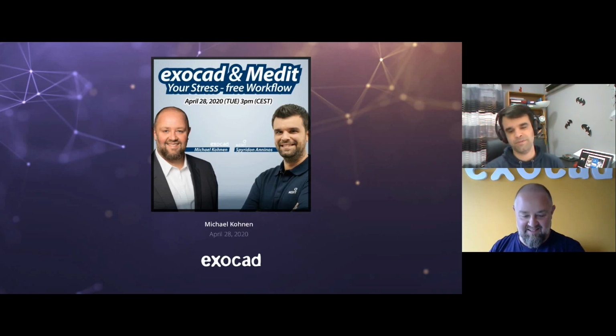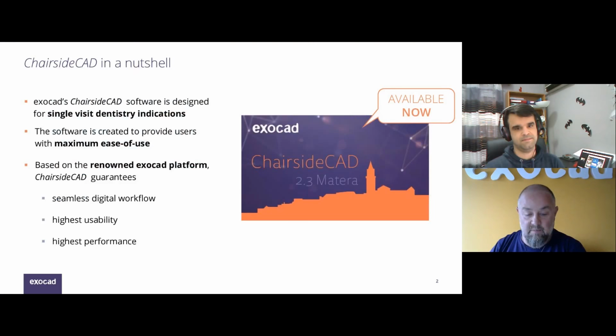Michael, it's your turn. Okay, thank you for the introduction. Last week I discussed with Spiros which product, dental CAD or chairside CAD, to be shown today. As the webinar shows how to scan with an intraoral scanner, for me the answer was quite clear. Therefore, today I'd like to take the opportunity with a very challenging case to demonstrate the possibilities with exocad chairside CAD. Some of you might think chairside is a slimmed down version of dental CAD, but in fact, that's not true. So today, I try to prove the opposite.